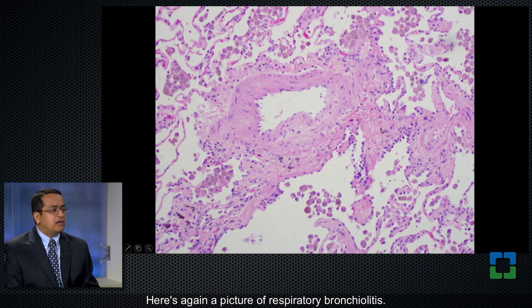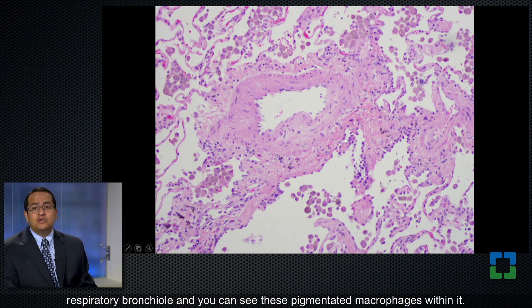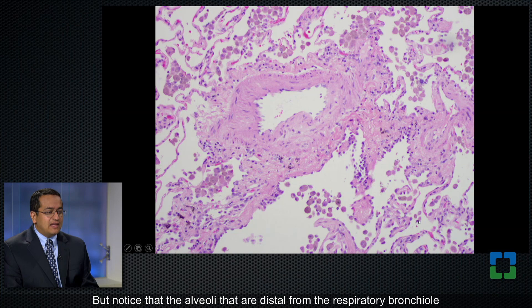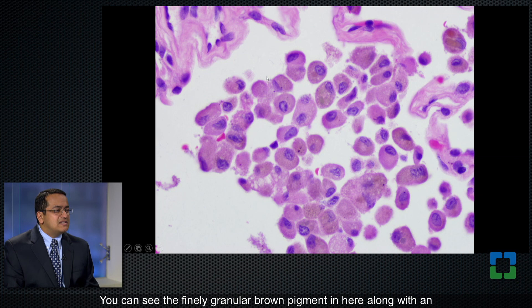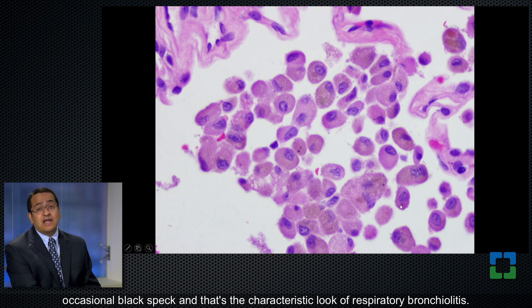Here's again a picture of respiratory bronchiolitis. This structure is a small pulmonary artery, and next to it is a respiratory bronchiole with pigmented macrophages within it. Notice that the alveoli distal from the respiratory bronchiole also have these macrophages — and it's still just respiratory bronchiolitis; it doesn't turn it into any other kind of entity. At high magnification you can see the finely granular brown pigment along with an occasional black speck, which is the characteristic look of respiratory bronchiolitis.